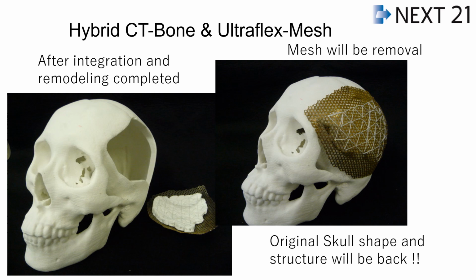After the transplantation, we periodically observe changes in bone density and morphological bone marrow structure to monitor the progress of bone metabolism. While confirming, determine when the mesh plate can be removed. Younger patients with rapid bone growth may require mesh plate removal after a period of time. But adults and older patients do not need to remove the plate.